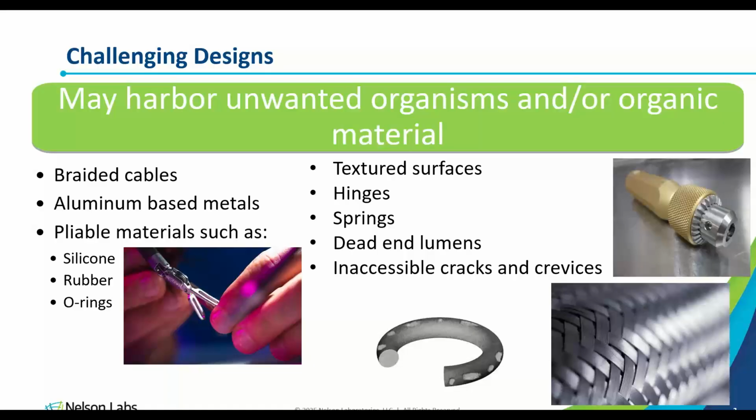Okay, on to the next one. Which methods could be used to evaluate the cleanability or disinfectability of a device during the development of the device? Okay, so which methods could be used to determine the cleanability of your device design during the design development?